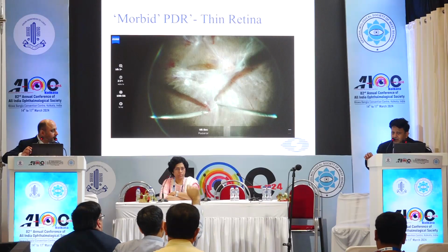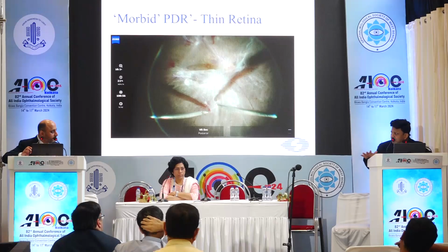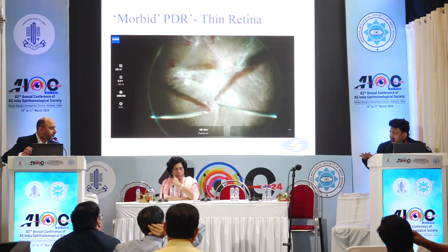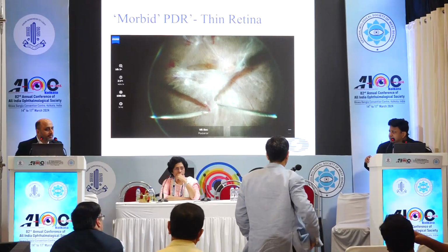But what I advise is, as soon as you lift the membrane, if you see that the disc starts bleeding, or even if a small ooze starts happening, just increase the bottle height and stop there. Stop for 3 minutes, right? And it will stop there only. It won't increase much.